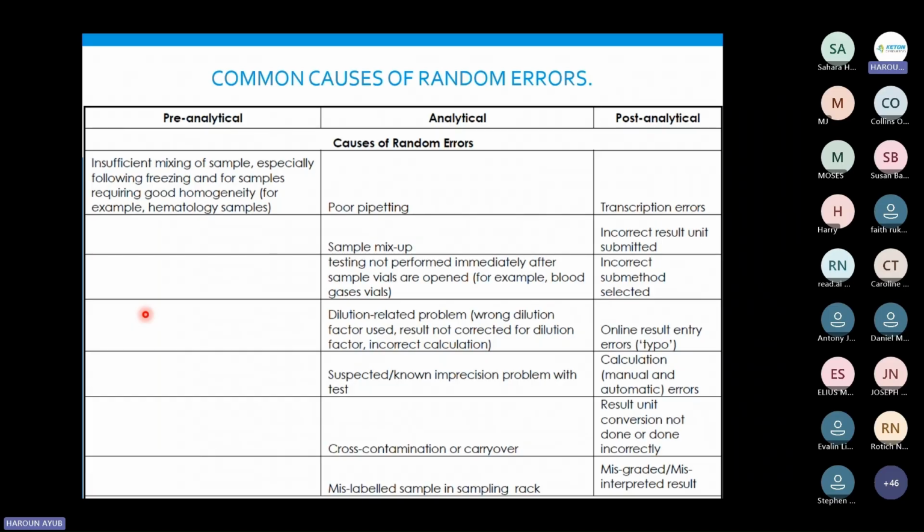If all goes very highly, I usually say you can use water for injection. At least that one they have been able to test, and you can check on those particular reports that are available online. Check water for injection, check the manufacturer, and be able to Google it, go to ChatGPT, and it will be able to give you the composition or the percentages of the solutions that are there. Also, the water tank that you usually open, leave it open for a while before you close it. That 20-liter bottle also gives very varied results. So it is very important to focus on the pre-analytical procedures.